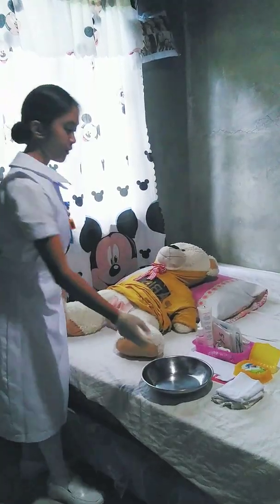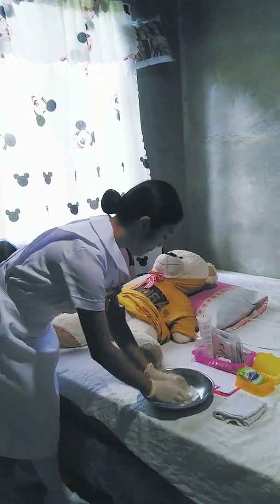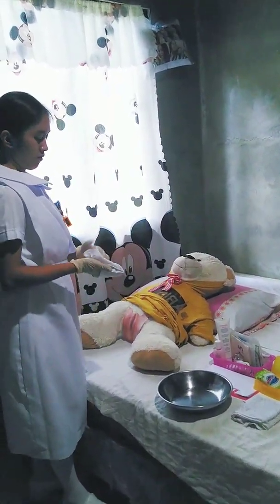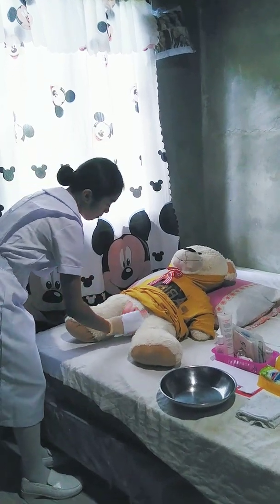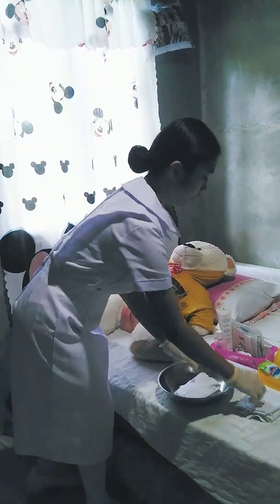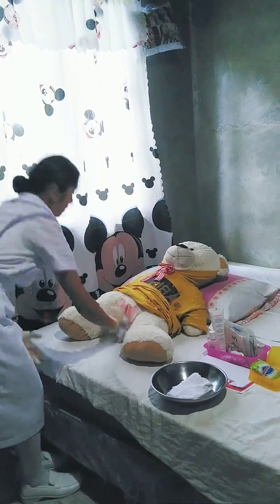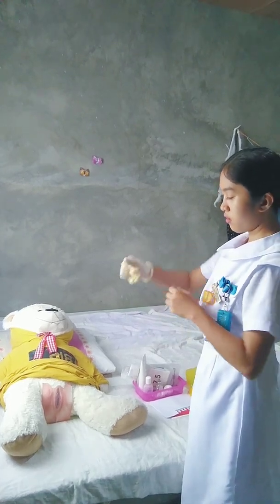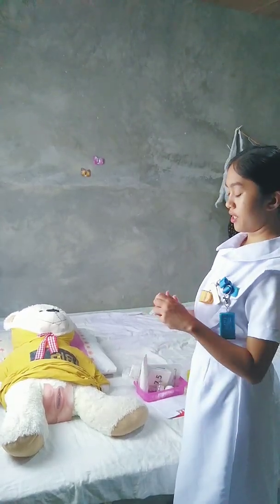Clean the perineal area with water and soap. Let's just imagine. Okay. And then clean from top to bottom, and then dry it. After cleaning the perineal area, remove the gloves and apply hand hygiene again.